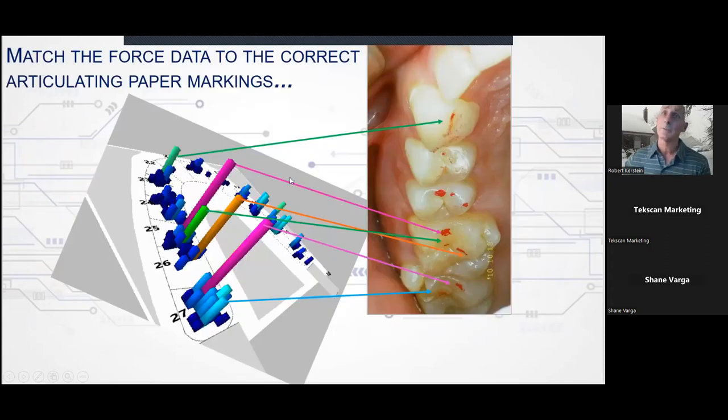This is a really good example I typically teach with. So this was an orthodontic patient who finished his bite after orthodontics. It was 65% left, 35% right. And you can see the imbalance in the 3D view. Here the right side was 35%, the left side was 65%. So mapping contacts, this is a really good example. This is the canine, right? That's up there. And then we come back a few contacts and we have some low blues.